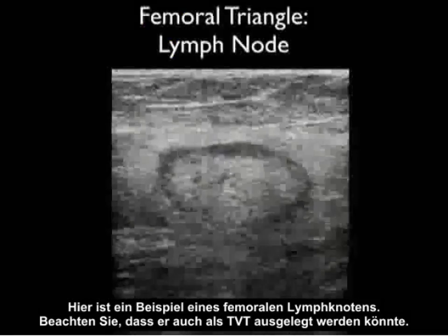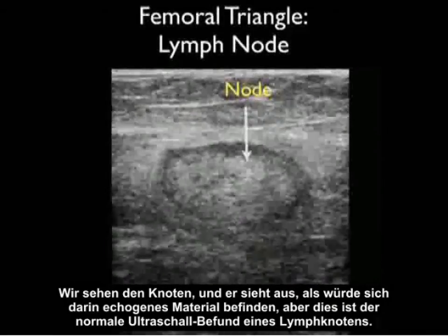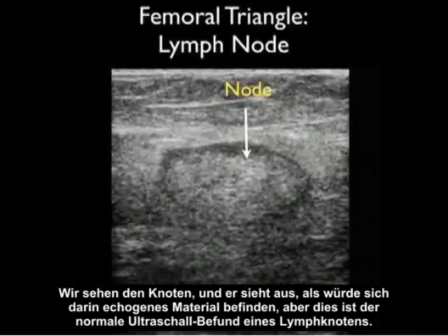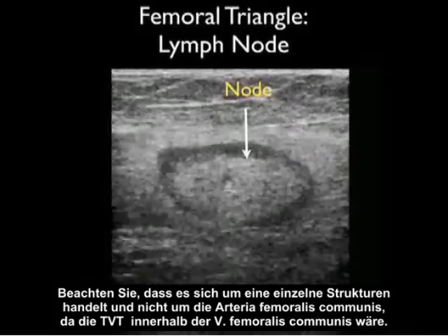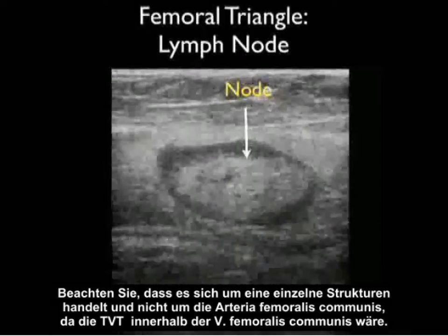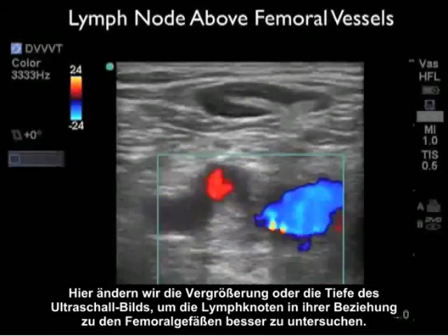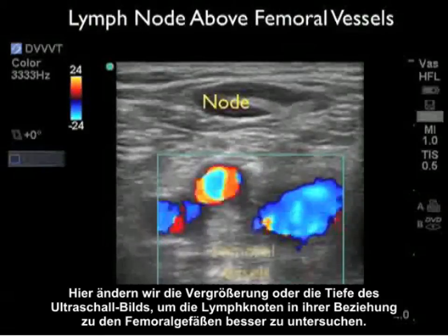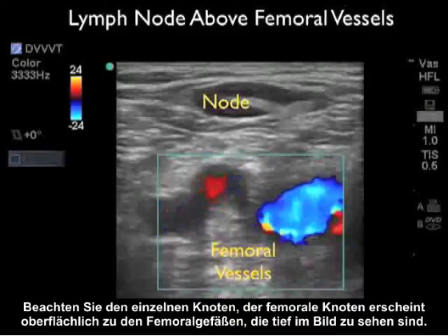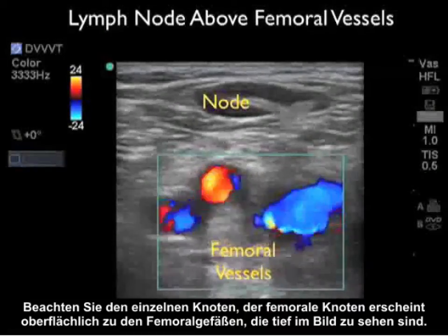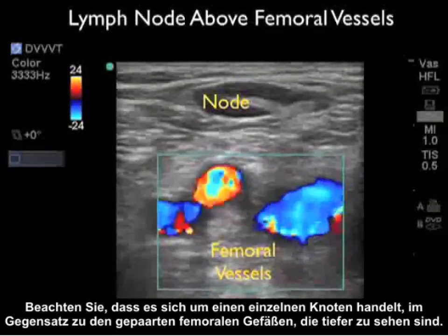Here's an example of a femoral lymph node. Notice that it has the appearance of what could be construed as a DVT — we see the node and it looks like it has echogenic material within it, but this is the normal ultrasound finding of a lymph node. Notice that it's a single structure and not related to the common femoral artery as a DVT would be within the common femoral vein. Changing the magnification or depth of the image to better investigate the lymph node in its relation to the femoral vessels, note the single node appears superficial to the femoral vessels seen deep within the image, in contrast to the paired femoral vessels seen deeper.